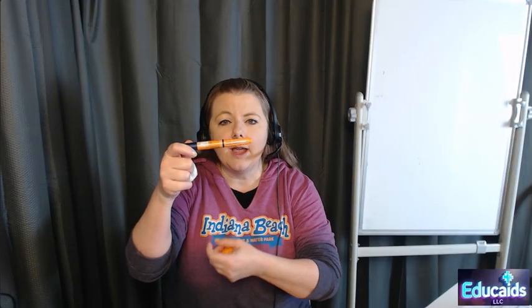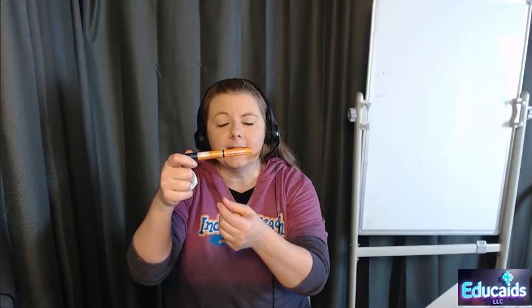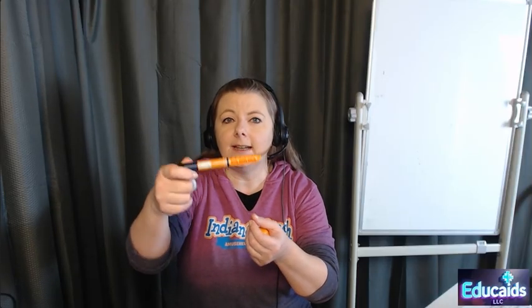Think of your pens as a vial, okay? So it's a vial of insulin, so you're going to use this again and again and again. So anytime we draw up medicine from a vial, we're always going to wash it off with alcohol first. So we're going to do that.